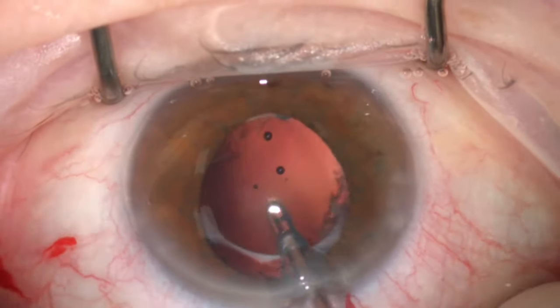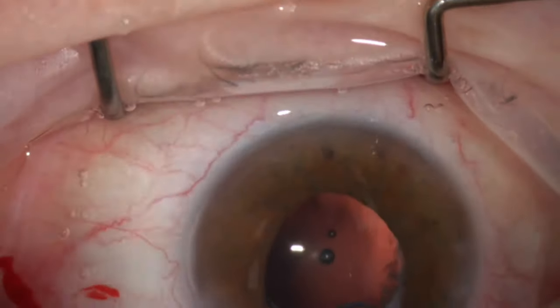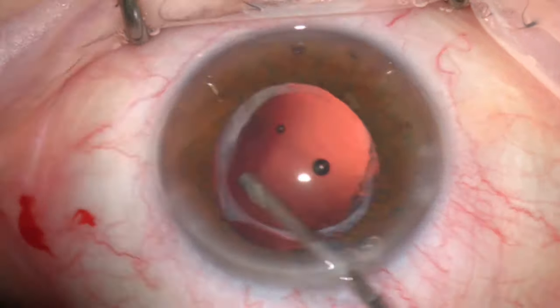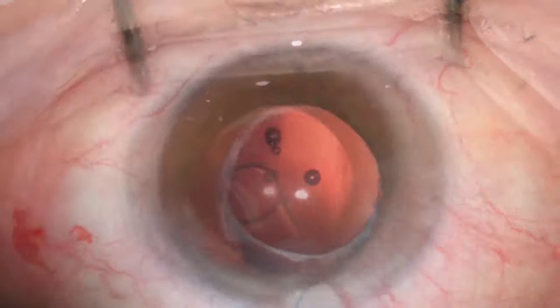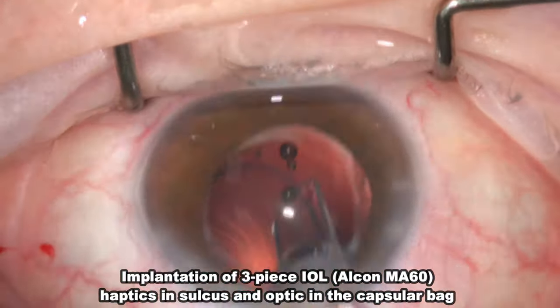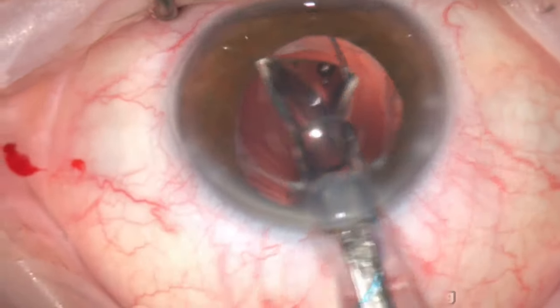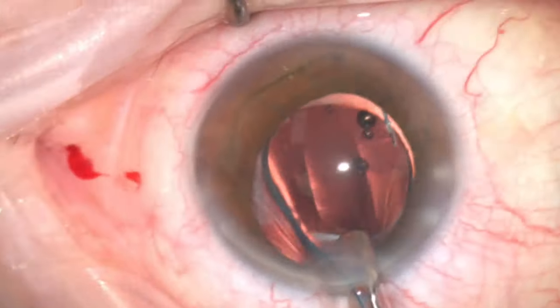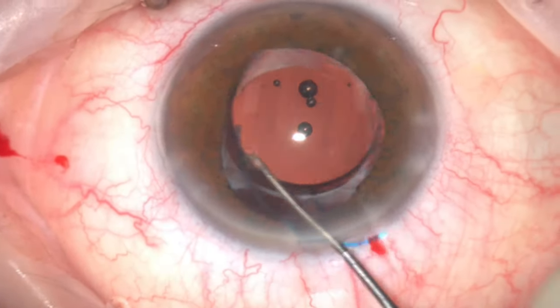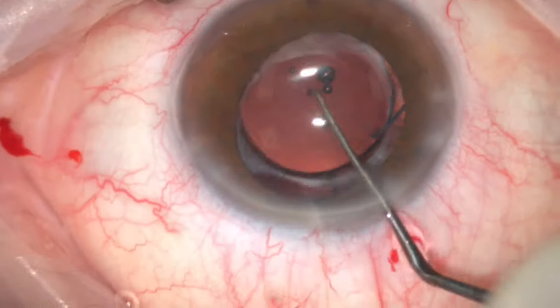A gentle irrigation aspiration was performed to clear any debris or residual lens fibers that were trapped inside the capsular bag. Since the capsular bag was compromised with severe zonular weakness, I decided to put in a three-piece lens implant. One tip to make the lens insertion easier is to rotate the lens clockwise while injecting the leading haptic, then counterclockwise while injecting the optic — this helps to place the lens in the correct position. The lens was rotated and the trailing haptic was pushed under the pupil in the sulcus.